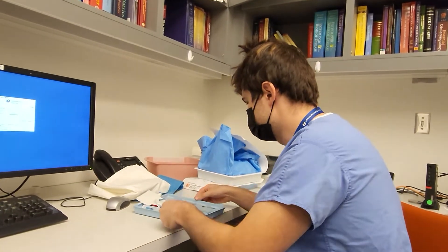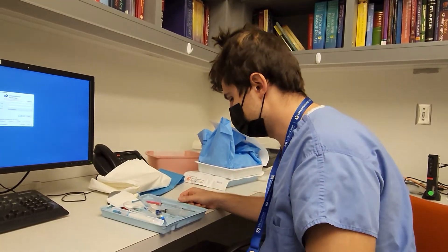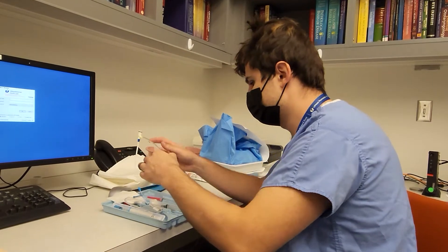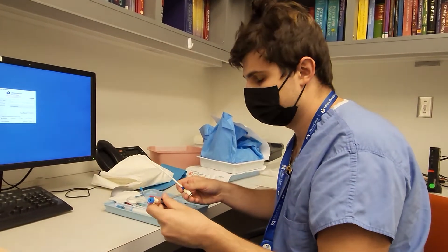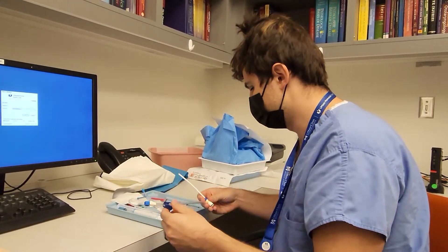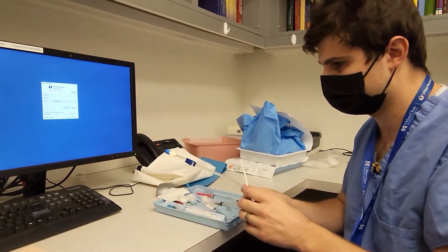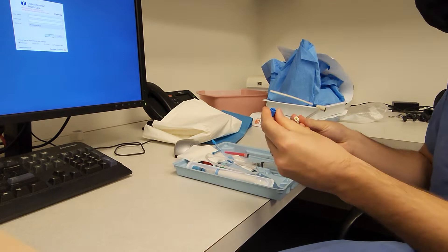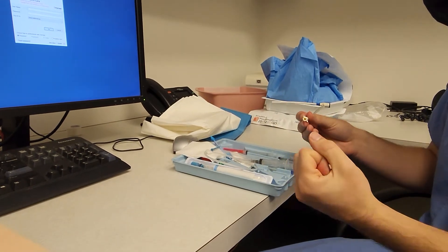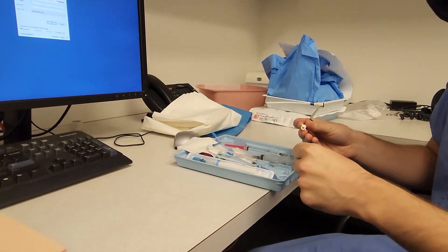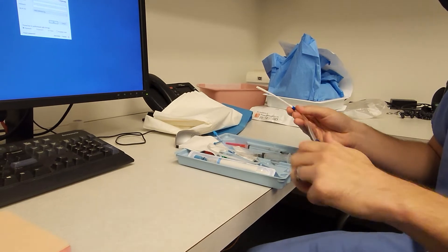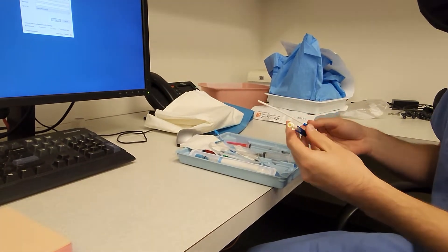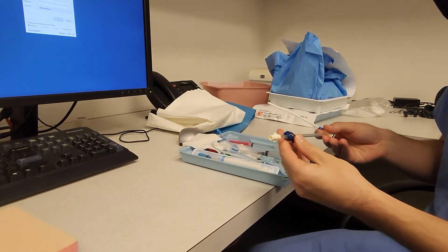All right, so I'm going to show you how to insert a cordis. First step is to flush the cordis. You need to take the cap off the end, get some sterile saline flush, and flush it through. And then clip it.